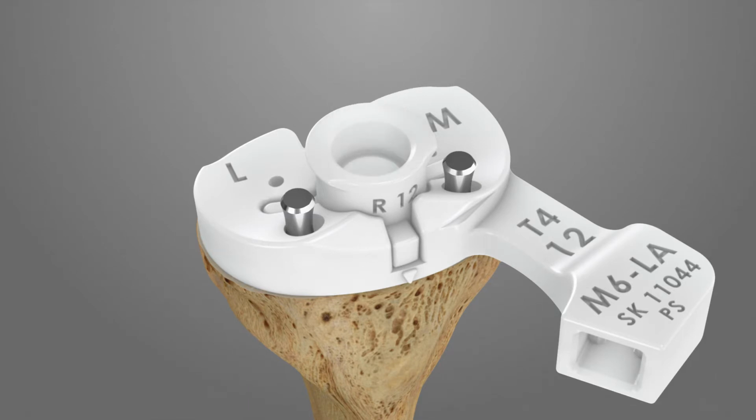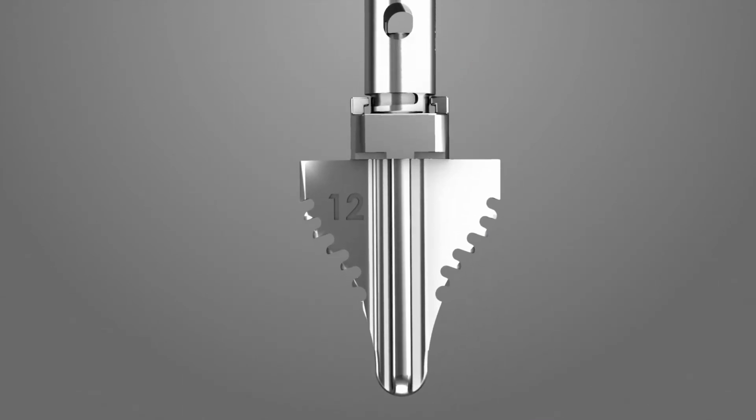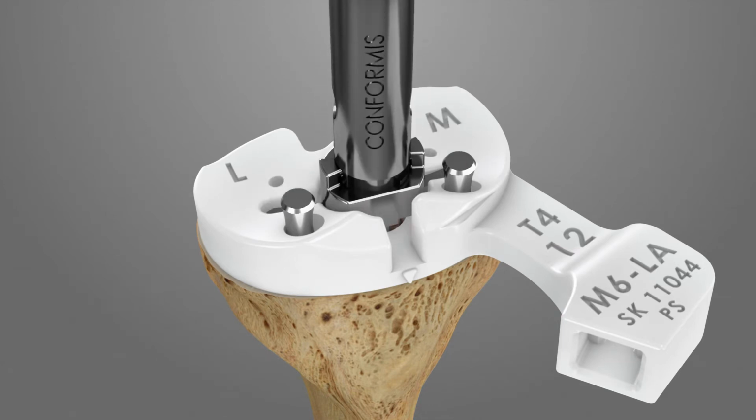The size of the stem drill bit and keel punch is indicated on the handle of the T4 iJig and on the iView. Remove the drill tower and attach the corresponding size keel punch onto the impactor handle and turn clockwise to lock it into place. Impact through the keel slot in T4 using the keel slot as a physical stop.